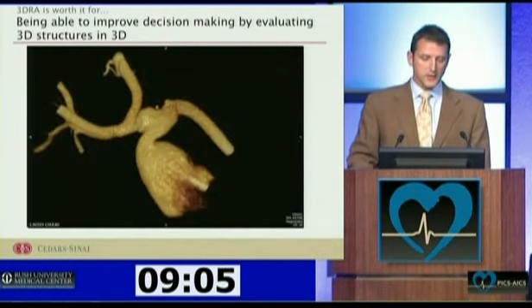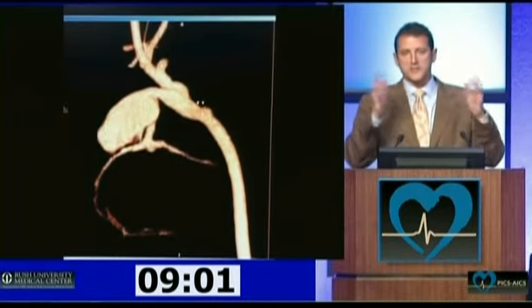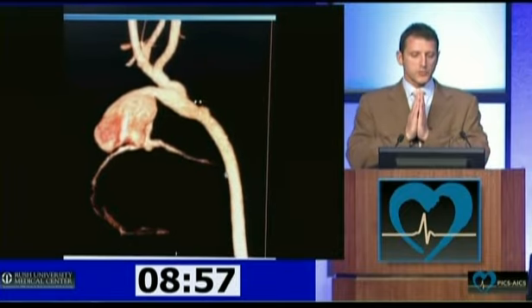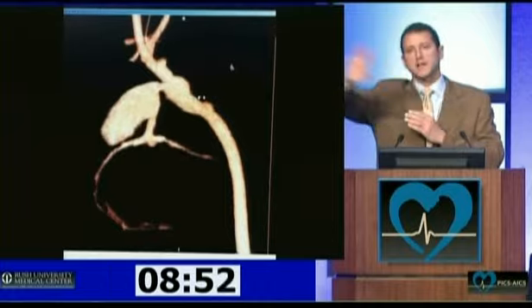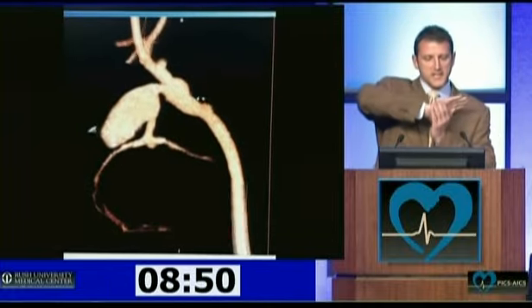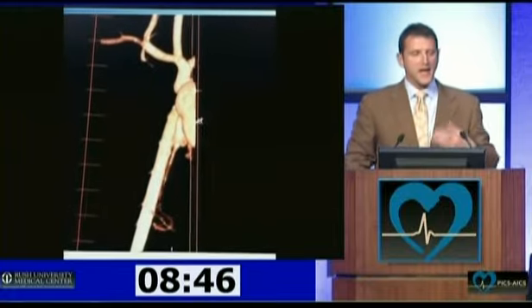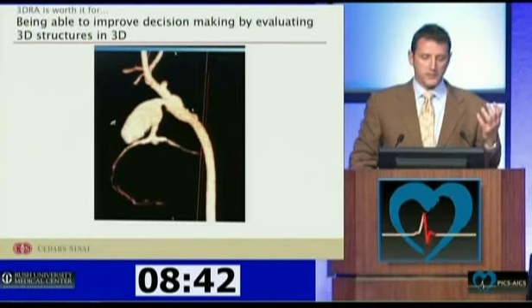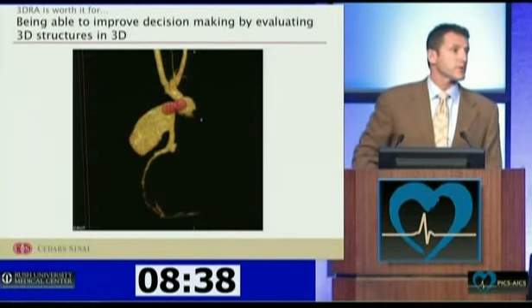And using the technology afforded to us, not just changing views now, there's software, and this is just one example, of where you can take these images and you can sort of drive through them, or picture a pane of glass where you can sort of eliminate as you go through. So in this case, we took away half the image and drove through it from the front and from the side. And with this kind of evaluation, again, real time at the table side, what I concluded, for better or for worse, is that putting a stent in this position would have been a pretty bad idea.